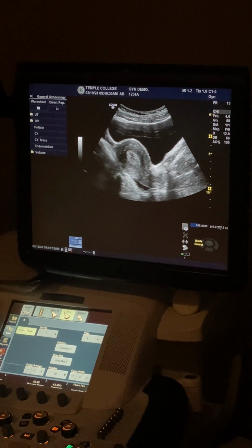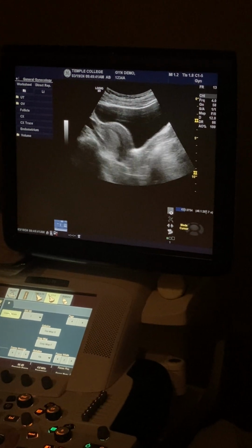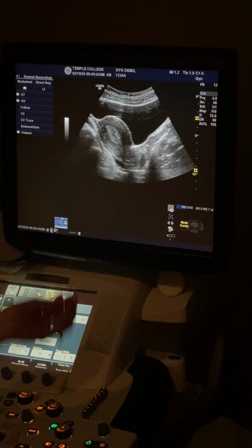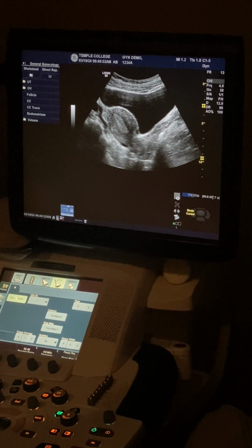That's not right. This is not typical in the clinical setting, just so you know. Just ask Bailey and Brandy from yesterday. It was awful. But this is what we're gonna need for you guys to learn, to get familiar with your structure, so when you get the things that are super tough, you can be like, no, I know how to find this. I know how to make this look okay.